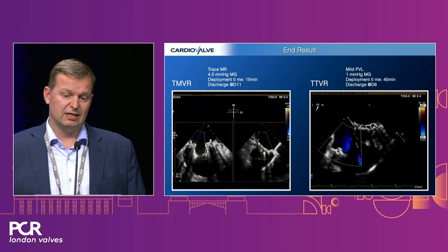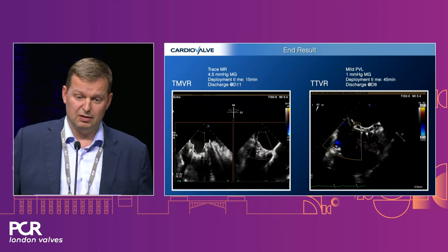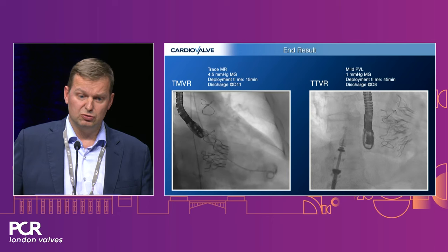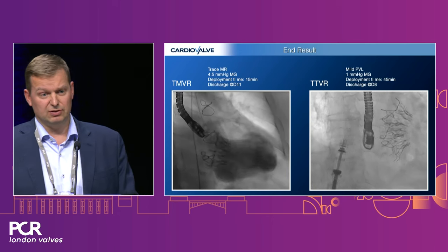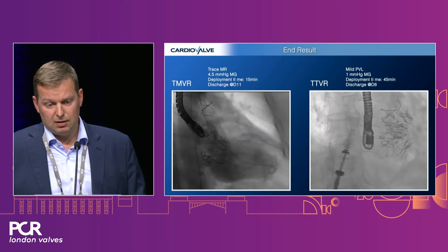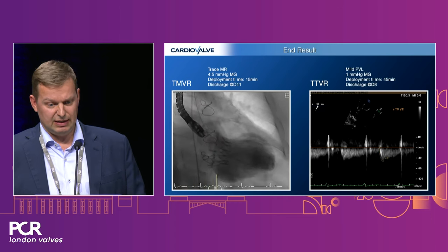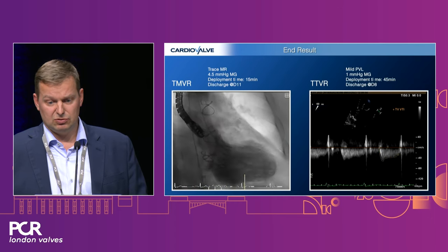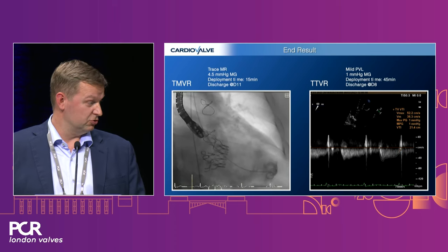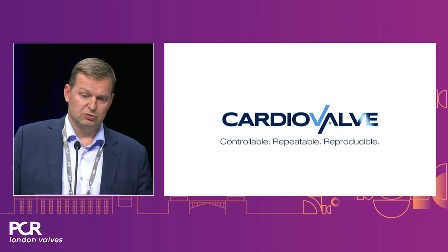And on the right side, the tricuspid, which has only a mild PVL, and which is really important, I think, is to check also the gradient on the tricuspid side. We also did an angio for the mitral, because it was a severe MR, and now you don't see any MR in the angio of the left ventricle. And again, on the right side, we measured the gradient. We also showed you this, which I think is really, really important to focus on.